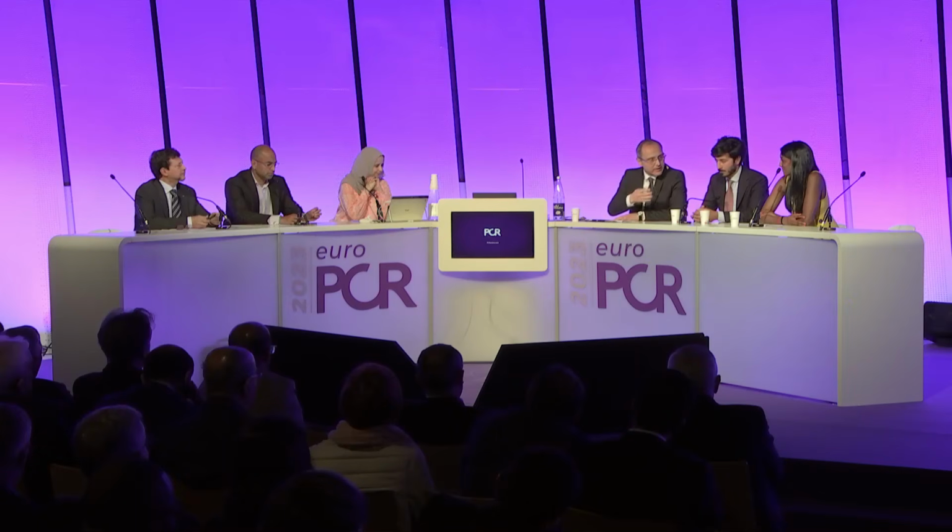Now let's move a step forward. We already heard our colleagues introducing IVUS, intravascular imaging. What did we learn from this intravascular imaging run? Any of you would like to take this one?